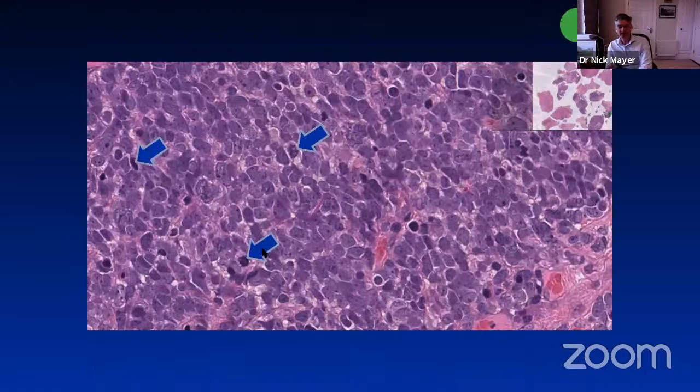And this is a fairly representative bit of the bluer areas. The arrows are denoting mitoses, and there were lots of those. The cells have stippling, but some small nucleoli as well, and limited amounts of cytoplasm, and show some quite nice molding.